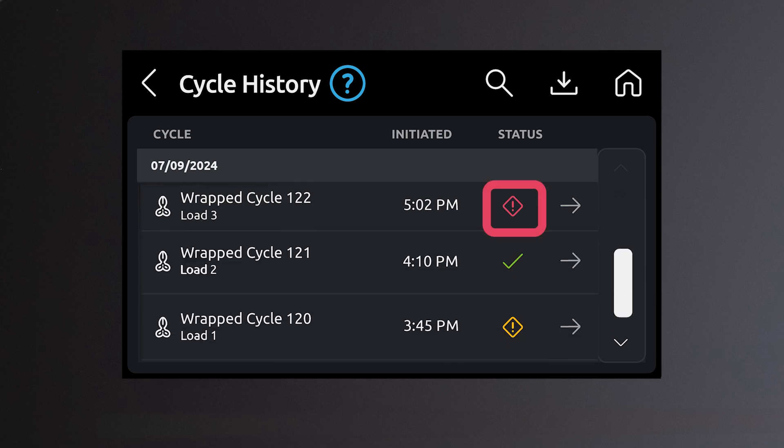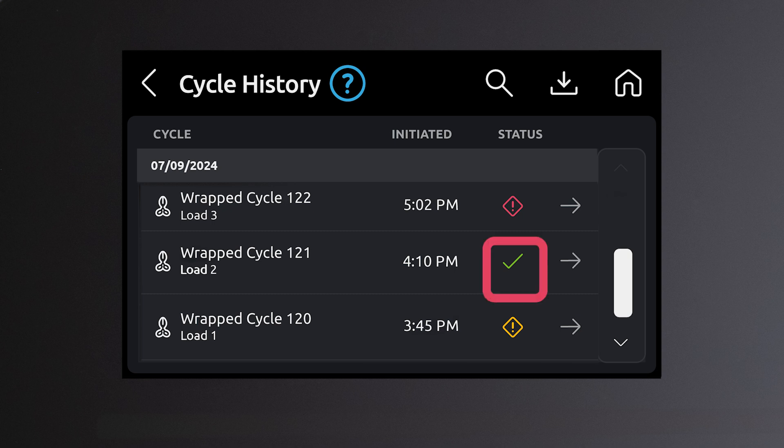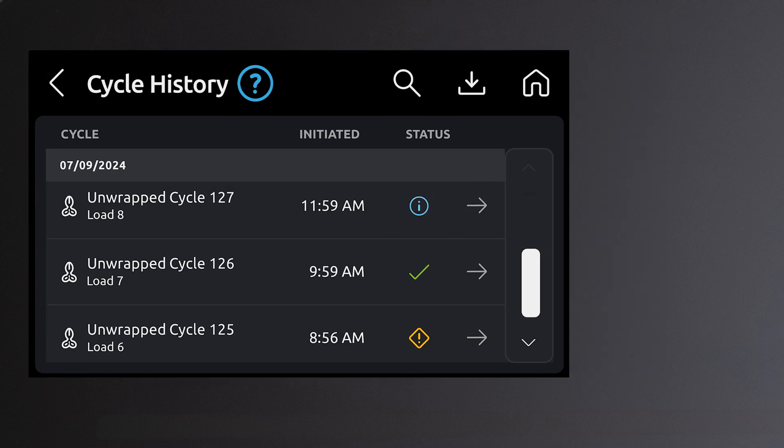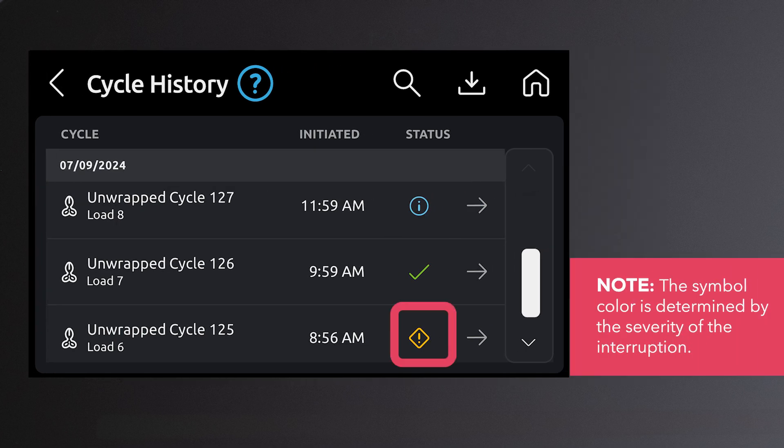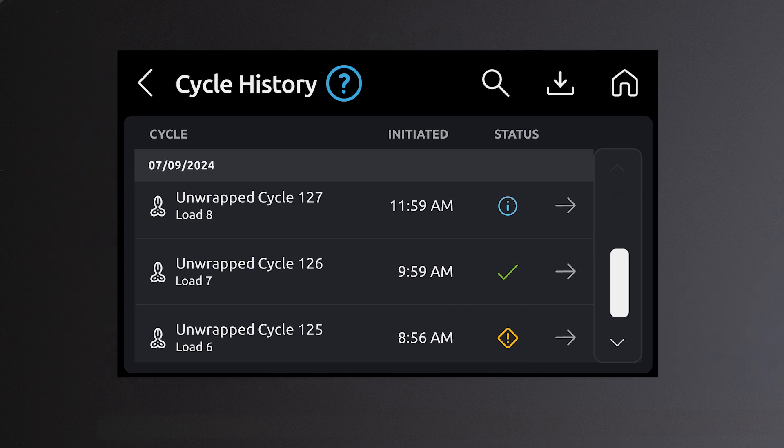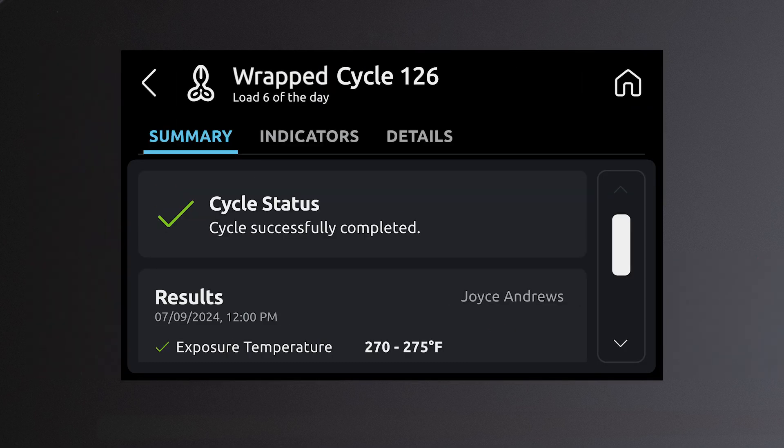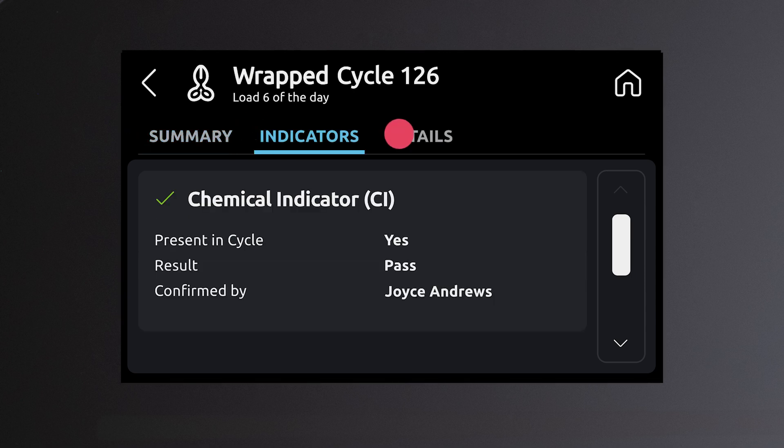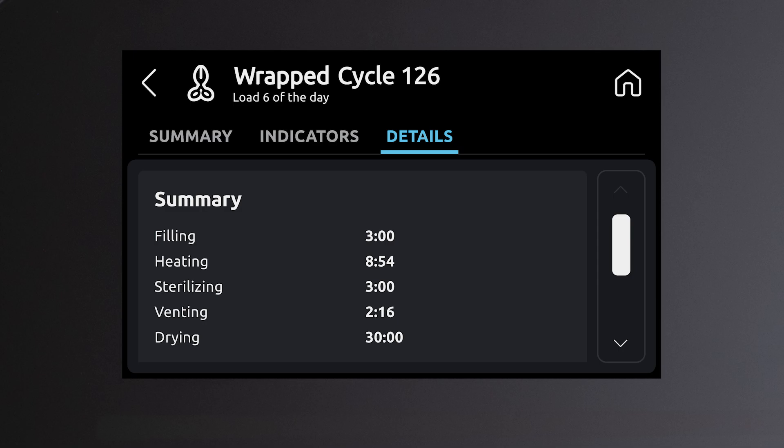The status icon indicates there is additional information required for the cycle. The checkmark icon indicates the cycle was completed successfully. The status error icon indicates the cycle was interrupted. The right arrow icon allows you to access detailed information such as the cycle summary, chemical indicator, and details of the cycle.